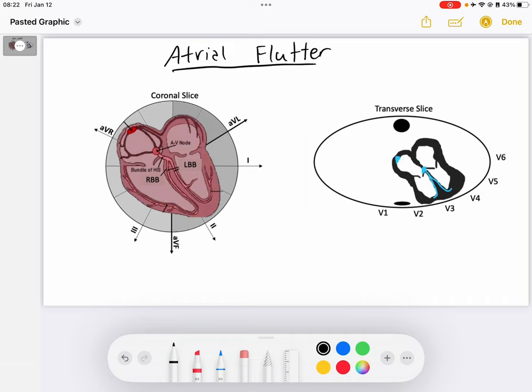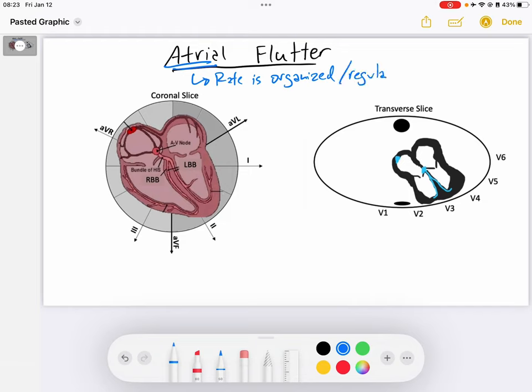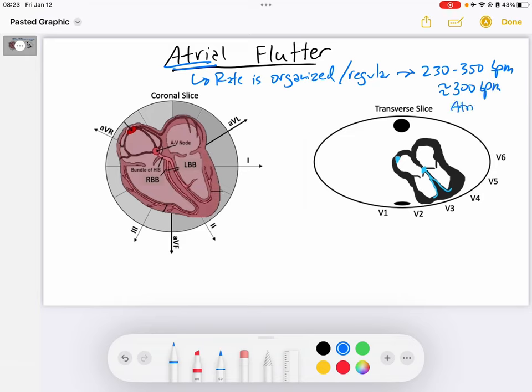Atrial flutter is, as its name implies, an atrial arrhythmia. It is characterized by an atrial rate that is organized — very regular — and it's occurring typically somewhere between 230 and 350 beats per minute. On average, we would say around 300 beats per minute is our atrial rate. That's our flutter rate.